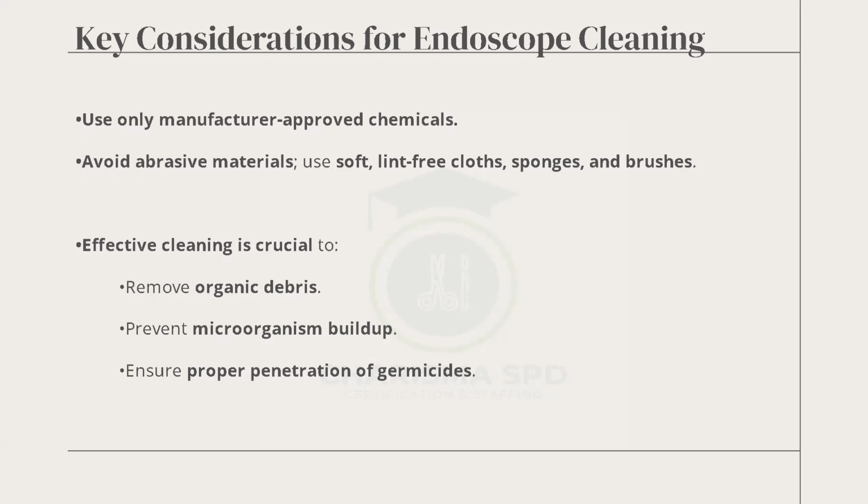So when the endoscopes are used in the OR, they're supposed to have some sponges that they wipe the shaft and the tip that went into the patient, which is bloody. They're supposed to wipe it with a sponge soaked with a detergent so that it will remove all those debris. But they don't do it. I can promise you that. They don't do it. They feel that it is somebody's job in CSPD, the decontam person. He will take care of it.